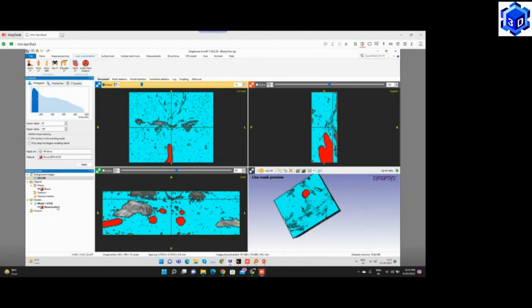It allows you to generate multiple mask models. If you have only this data set and still want to generate different masks of different regions out of it, you have the flexibility to do that. You can use this dataset browser for that. And that's pretty much it. This is the basic workflow of the software.